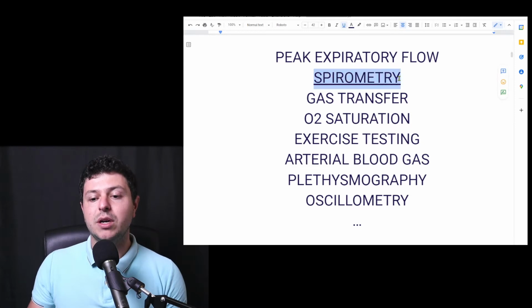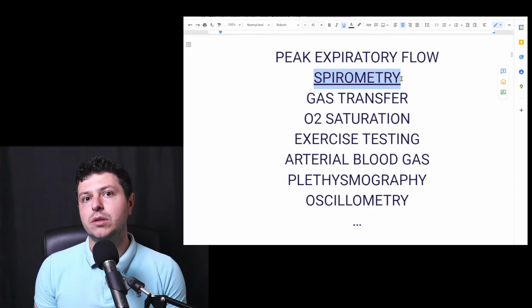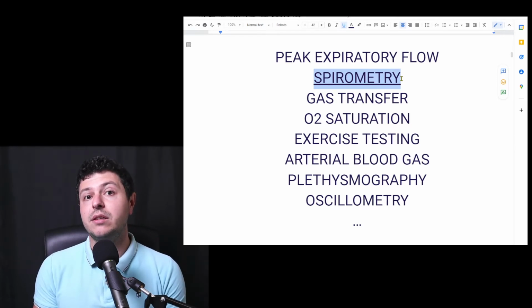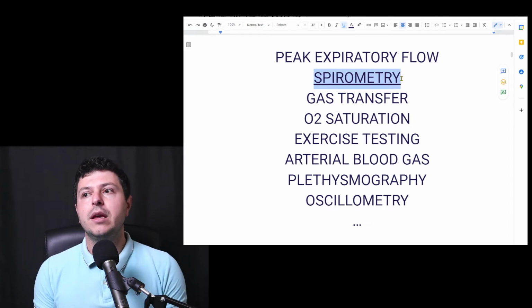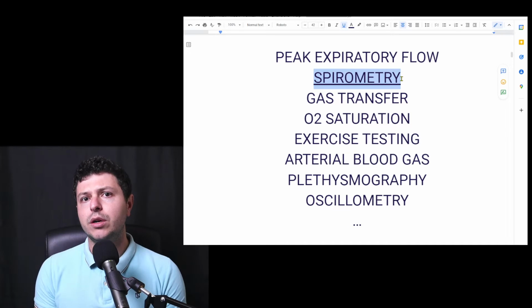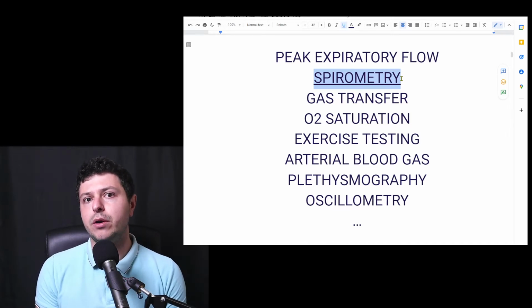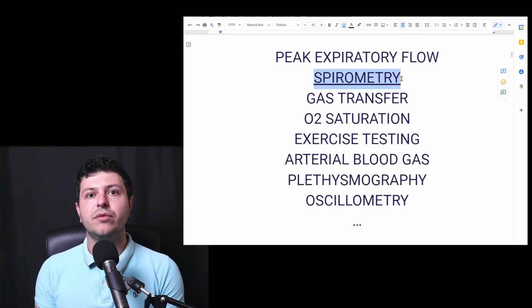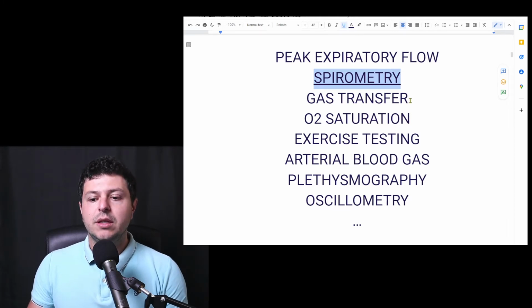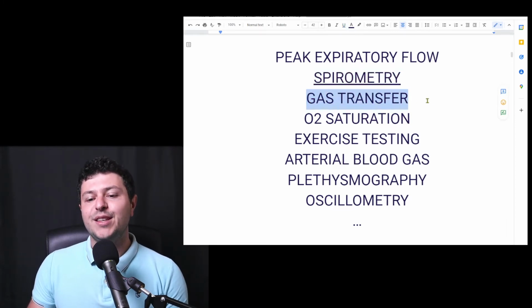Spirometry, however, is something that I will focus on extensively in this video, if you have the patience to watch toward the end with the examples and everything else, because it's a fairly comprehensive test in the hands of a specialist who knows what to look out for and integrates the results of spirometry with the rest of the medical information. In that case, it can actually be a very helpful tool, and you'll see towards the end of the video. Gas transfer is something added on top of the spirometry.